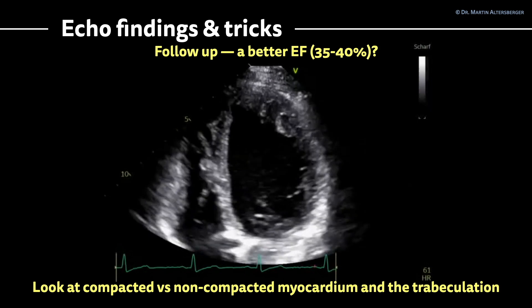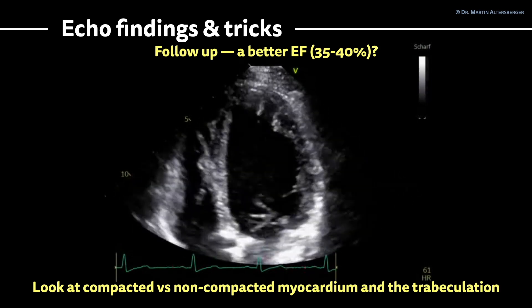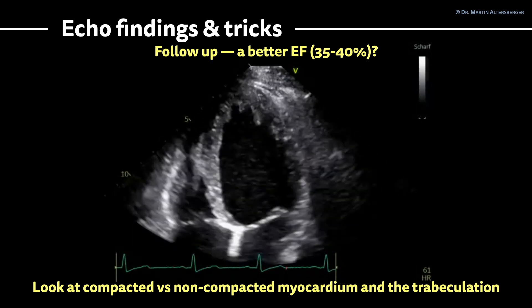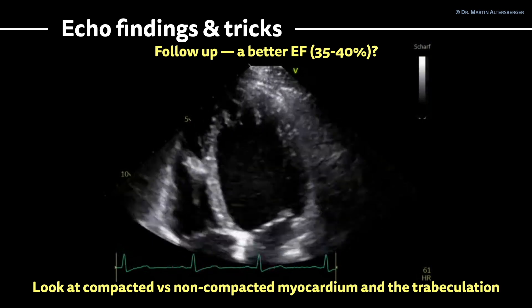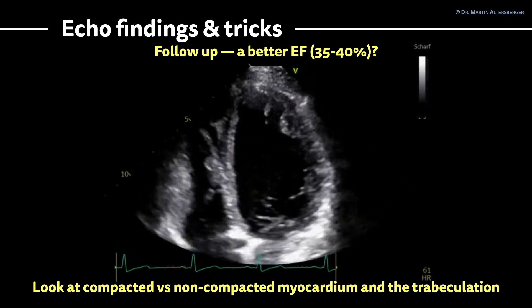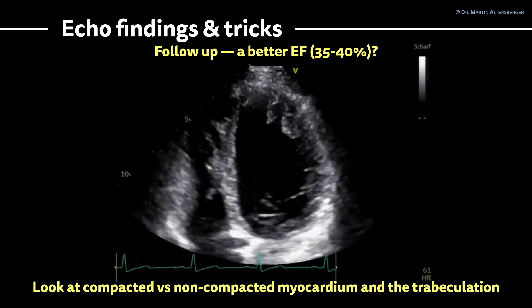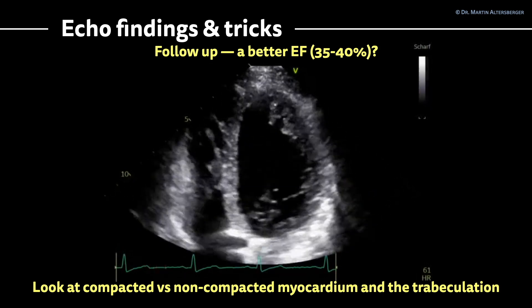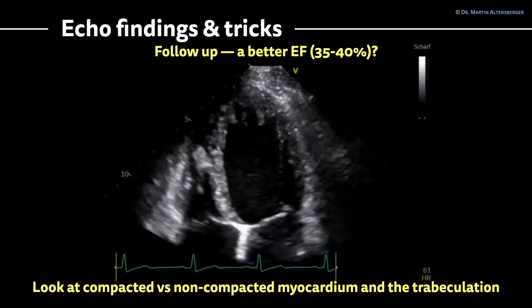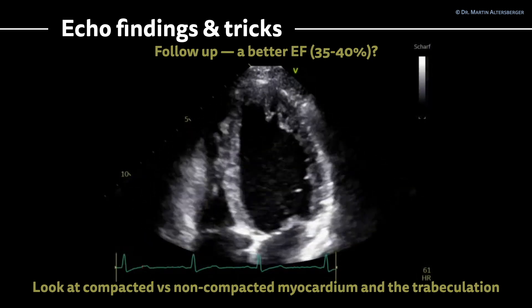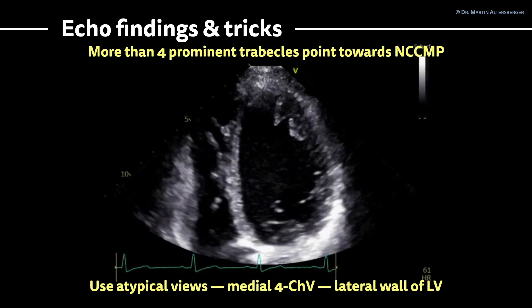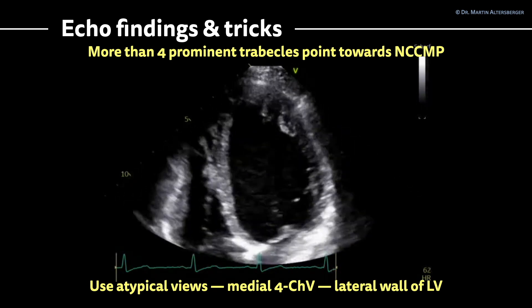A few weeks later with heart failure treatment, follow-up showed ejection fraction visually looks definitely better — in the range of 35 to approximately 40 percent. Look at the compacted versus non-compacted myocardium especially in the apical and apical lateral regions. When you see more than four prominent trabeculations, it points toward non-compaction cardiomyopathy — keep that in mind.